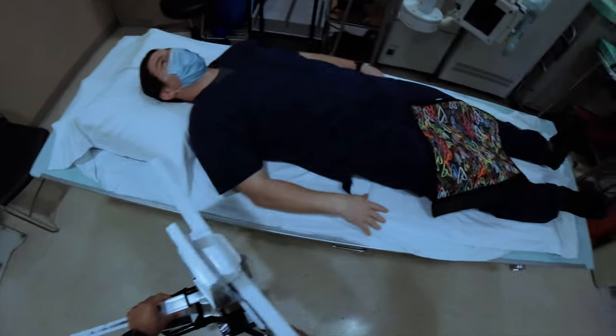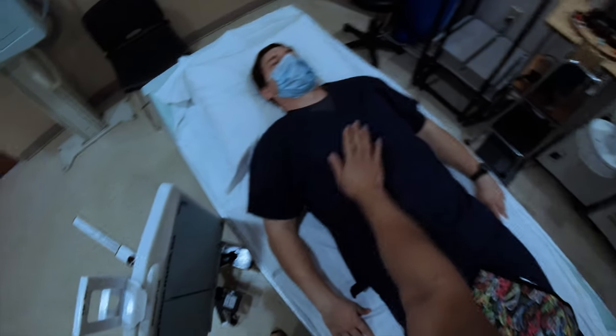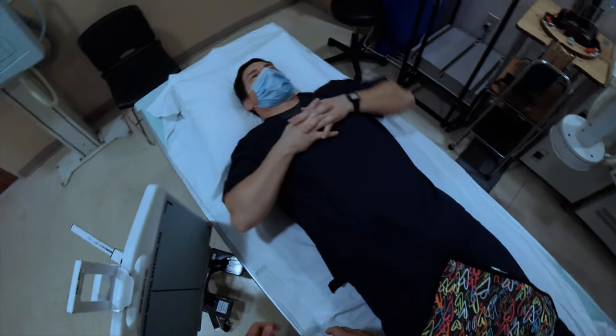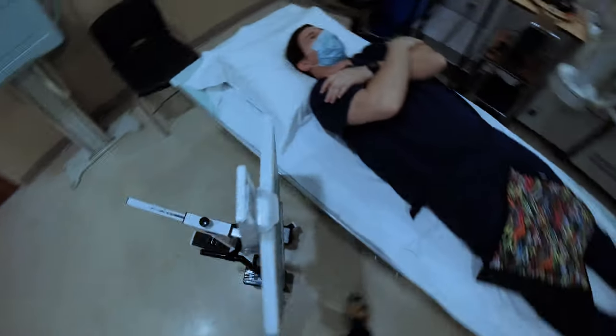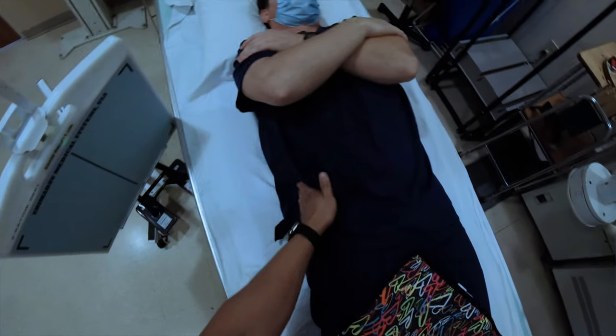Sorry to hear that. We're going to cross your arms high across your chest. Put your elbows up there, so kind of... There you go, good, thank you. Just going to feel your hip here again.